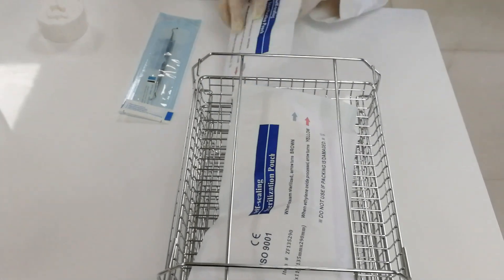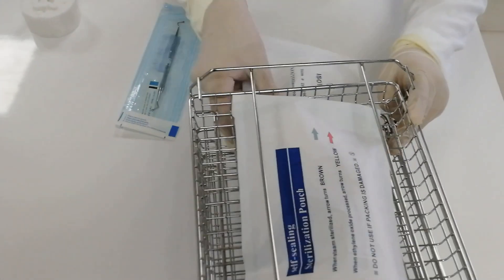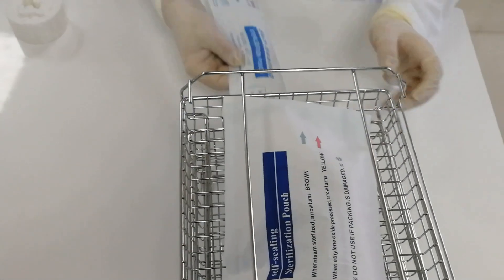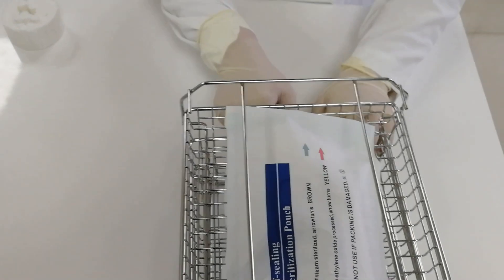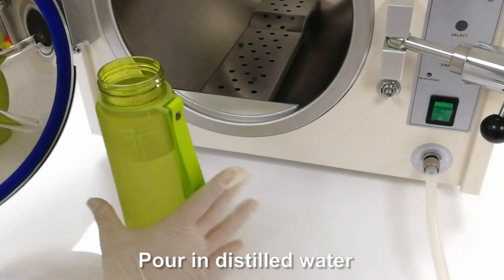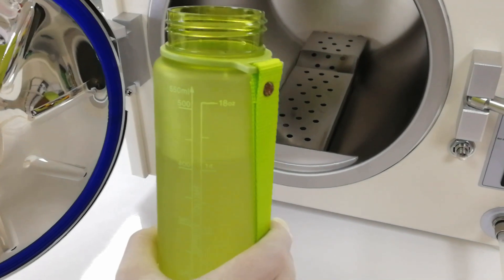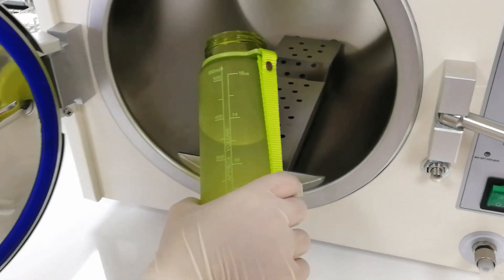Now we put the sealed bags onto the tray. We're using the measuring cup and pouring the correct amount of distilled water.